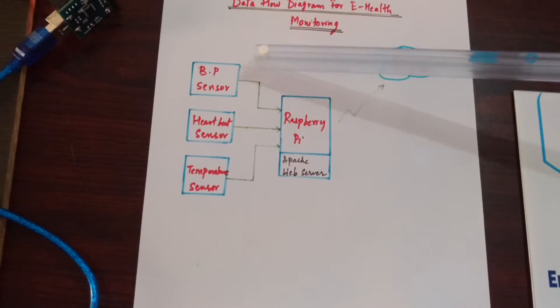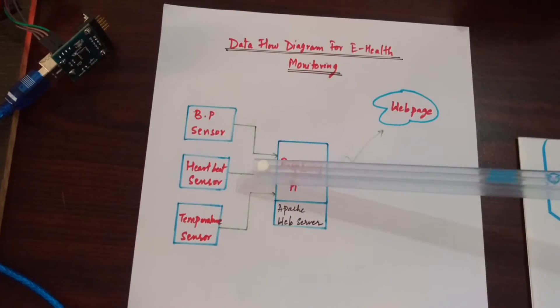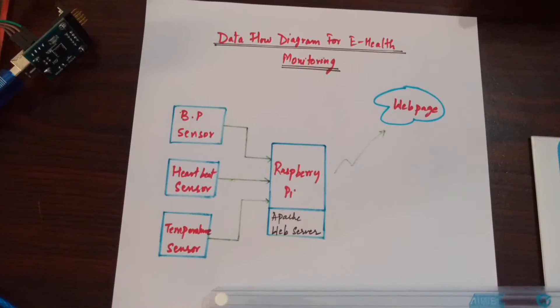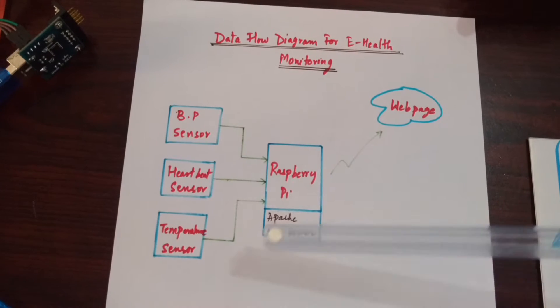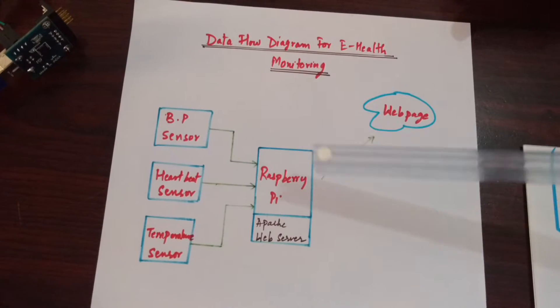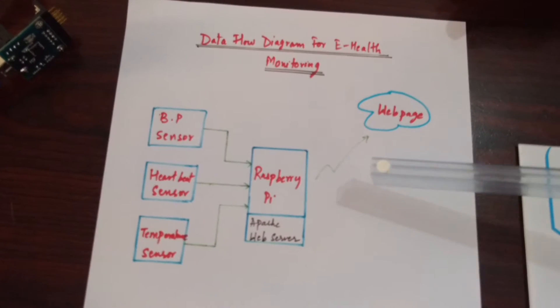We have a BP sensor, a heartbeat sensor, and a temperature sensor which is connected through USB to Raspberry Pi.